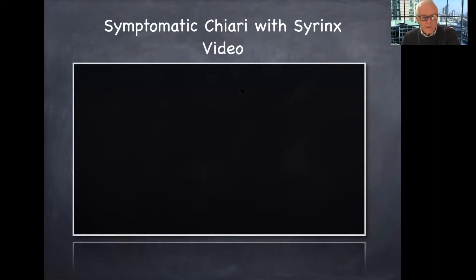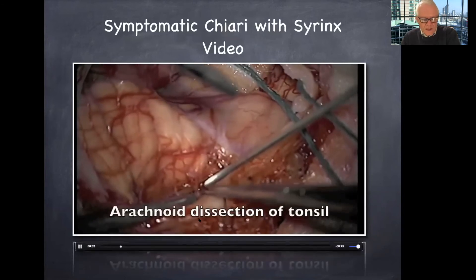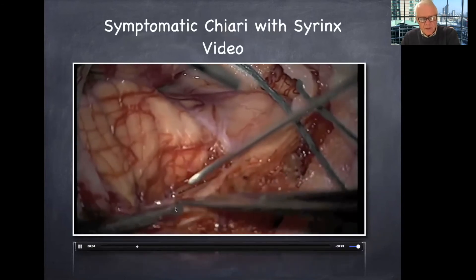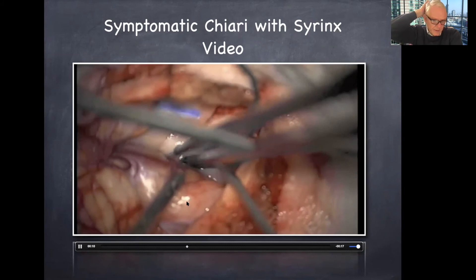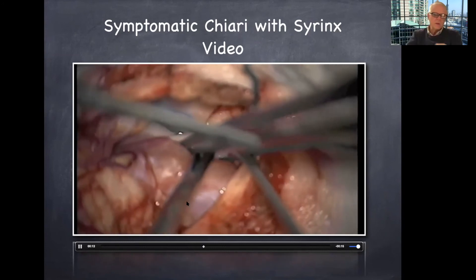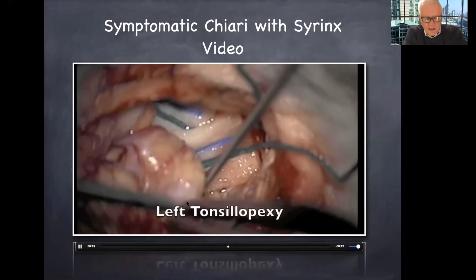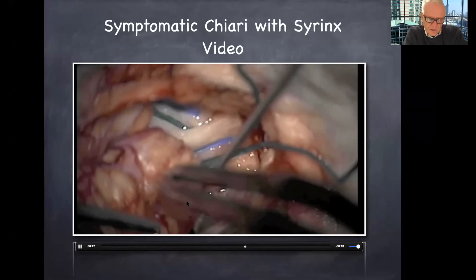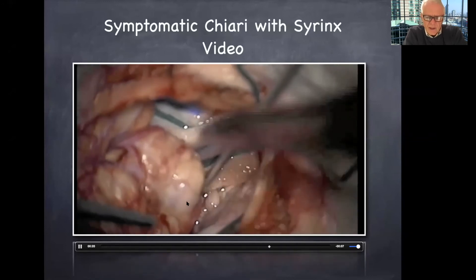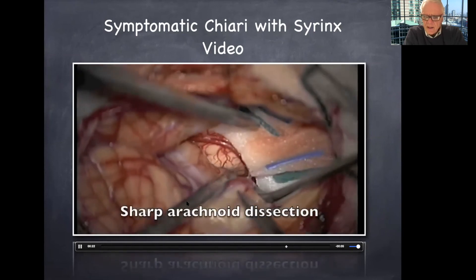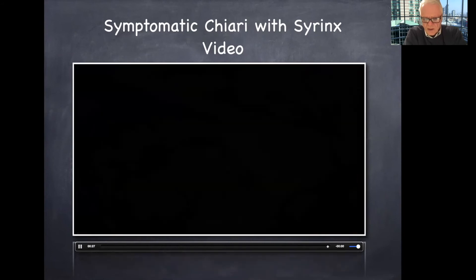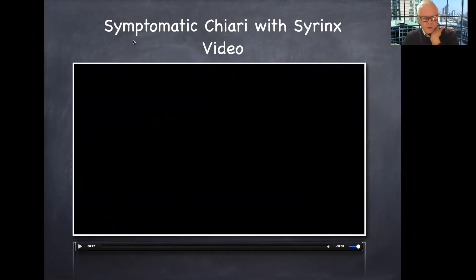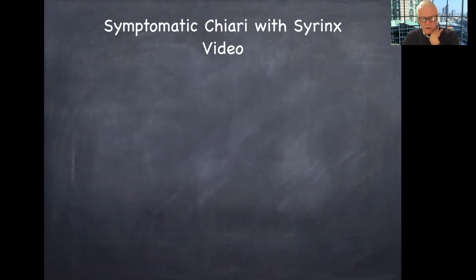Here's the video on this case. We're doing some dissection of the arachnoid. We've already opened up the dura and taken the bone off. Now we're preparing the cerebellar tonsils for the tonsilopexy. We do coagulation just like that, rounding up the tonsils. This is very well tolerated and does not seem to cause any significant underlying disturbance. All of that's done under the microscope, at least in my institution.